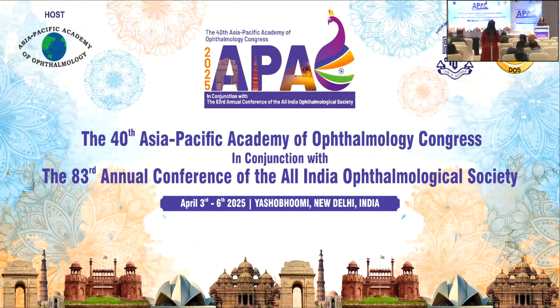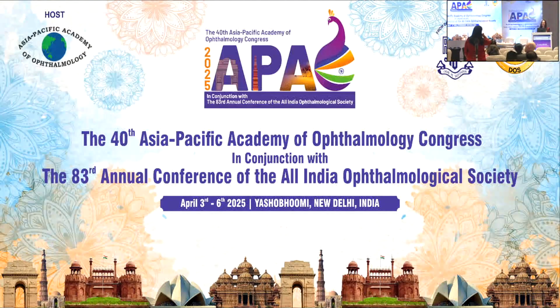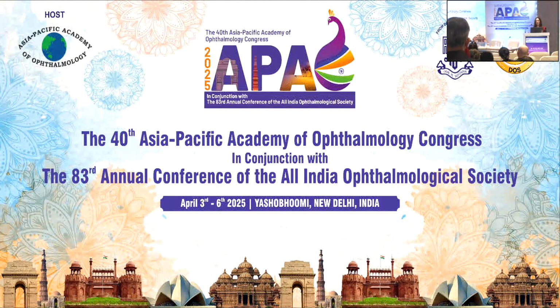Nice talk, Audrey. Two observations. ICL, contrary to IOL, corrects the total eye refraction. So why look at the corneal astigmatism axis and not correct what the refraction is? Well, that's what I did, actually. I just like to look at it to see what it is. But yes, I go with the manifest.